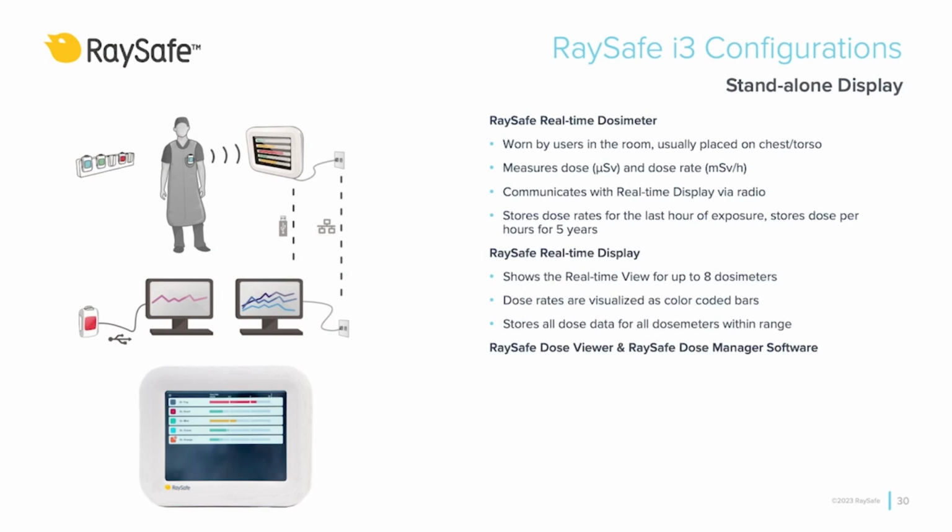When radiation is picked up by the dosimeter, the dose rate is visualized as a moving colored bar on the screen. The screen is updated every second, so you can easily follow how your movements or actions affect your dose rate. Data is stored on the dosimeter itself, but it has some limitations compared to the screen. The screen will save all data for all dosimeters, and the memory is big enough for you to never have to worry about losing any data.